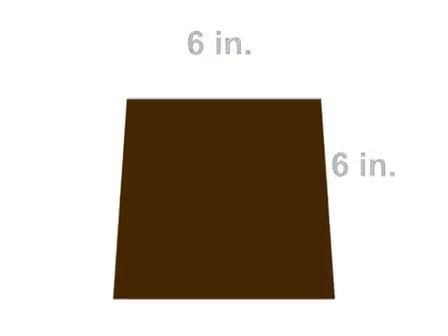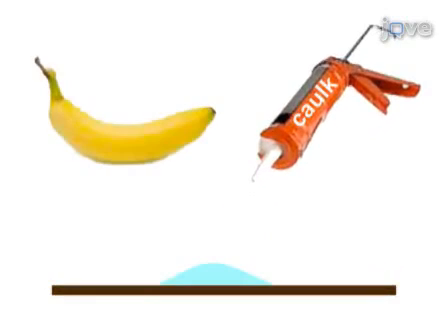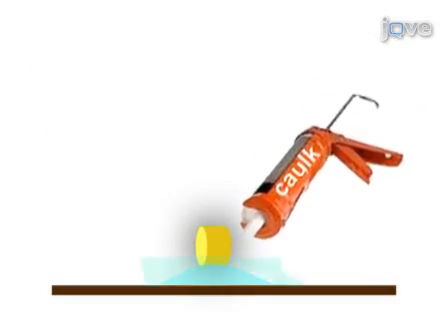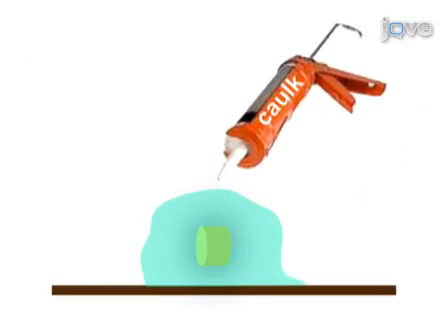To prepare a phantom lesion, cut a 6 by 6 inch piece of cardboard to serve as the base plate. Cover the base plate with a layer of caulk 1/2 inch thick. Then, cut a piece of banana 2½ inches long and press it gently into the caulk. The banana serves as the phantom lesion core. Completely embed the core in caulk without trapping air bubbles.